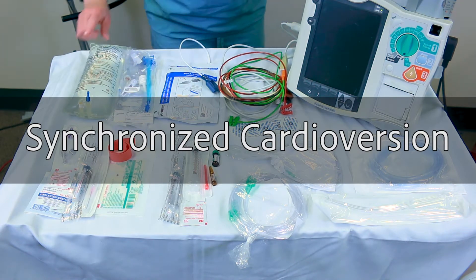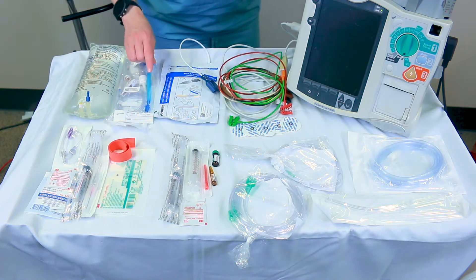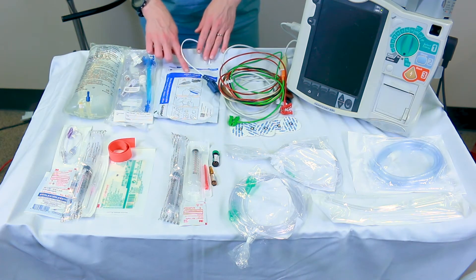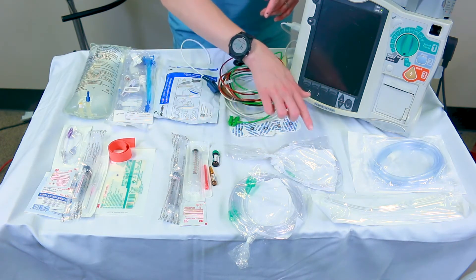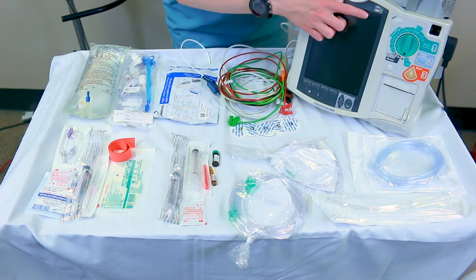You will need IV start supplies, 1-liter IV solution with primary tubing, ordered medications with syringes, defibrillator pads, 5-lead cable with electrodes, nasal cannula with oxygen tubing, Yankauer suction with tubing, and a biphasic defibrillator with a crash card at bedside.